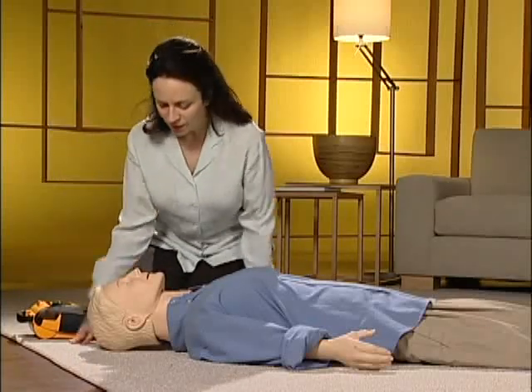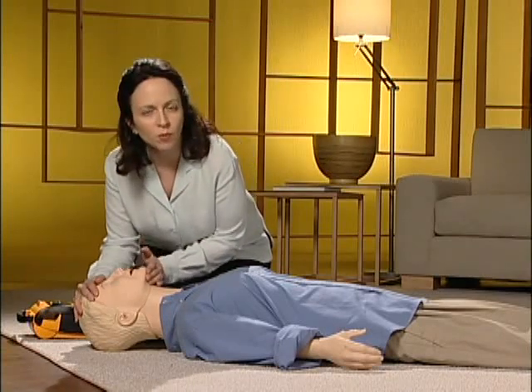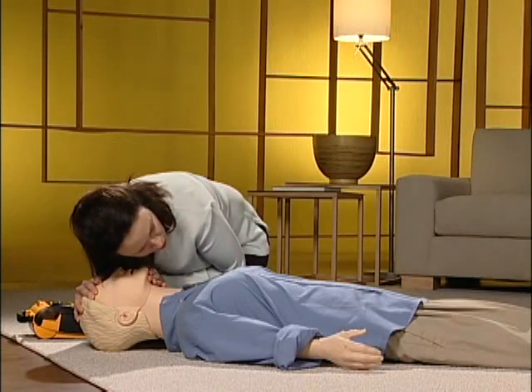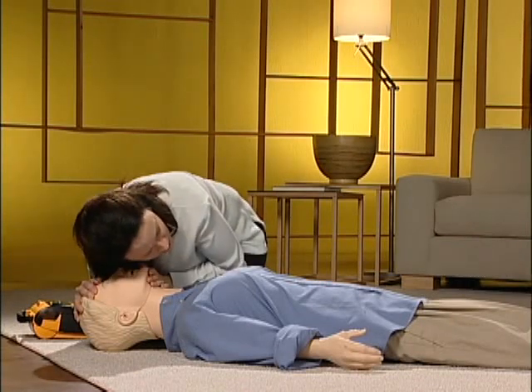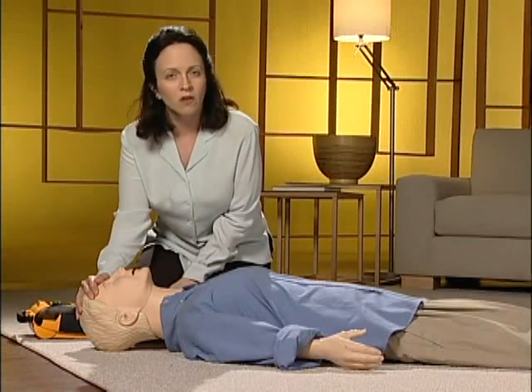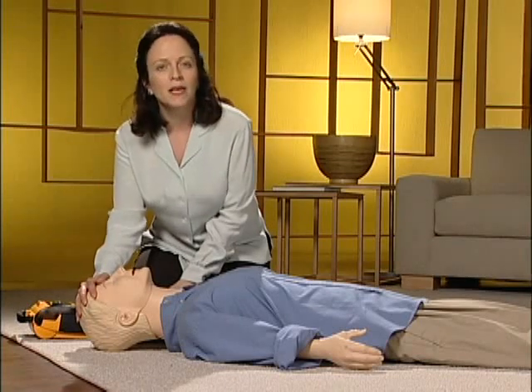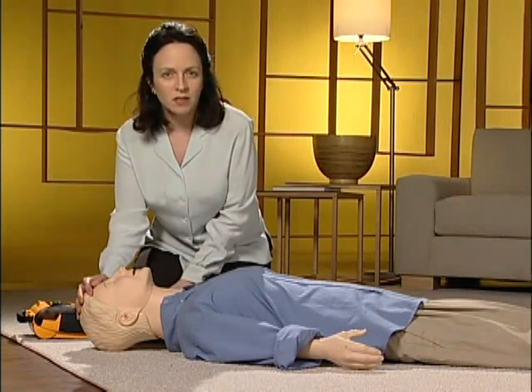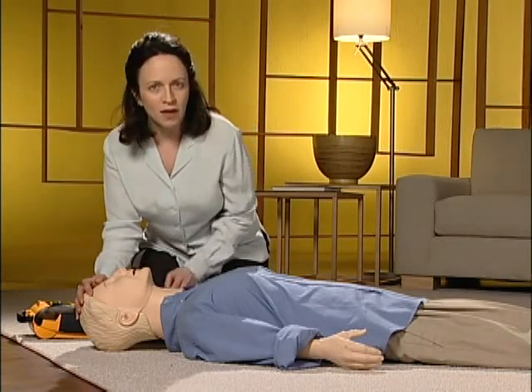Next, open the airway. Tilt their head back and lift their chin, and check for normal breathing. Place your ear over their nose and mouth and listen for breathing. Look at their chest to see if it rises. A person in cardiac arrest either does not breathe at all or has abnormal breathing — again, abnormal breathing might be gasping or snoring breaths. If they're still not responding and you don't see or feel normal breathing, give two breaths.